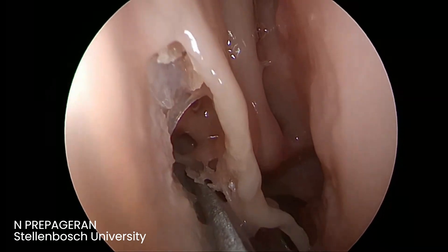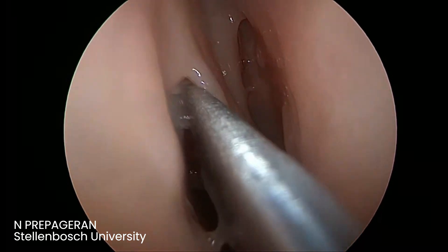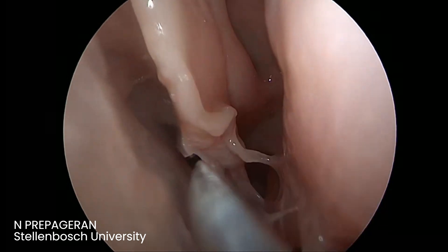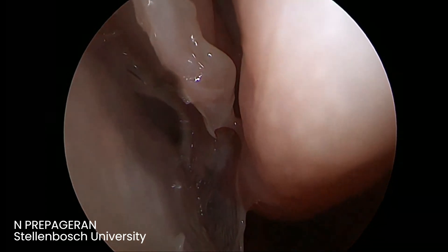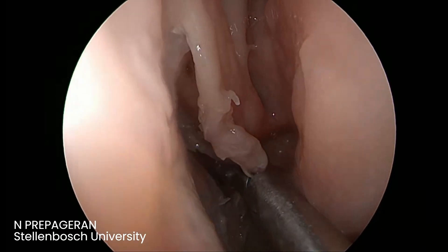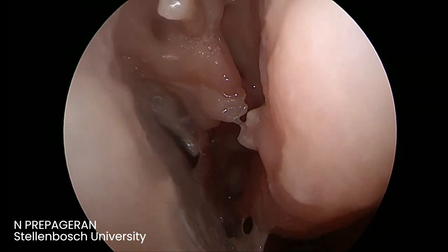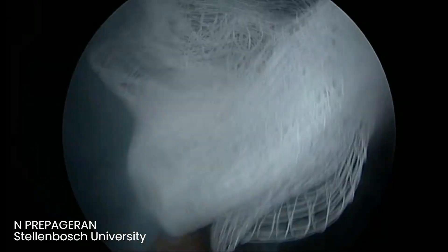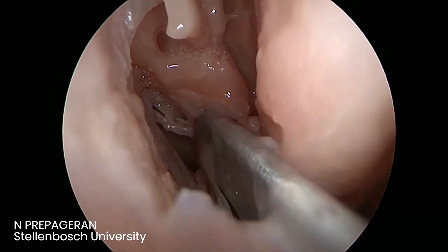You actually enter along the full length from top. See? The same way you go up — top at mid portion. So this is the tail that I was telling you about. You can cut the upper part of the uncinate as well, and this gives us the maxillary sinus open. Now we have gate number one open. Can you see? Gate number one is open now, and we have the maxillary sinus exposed to the top.